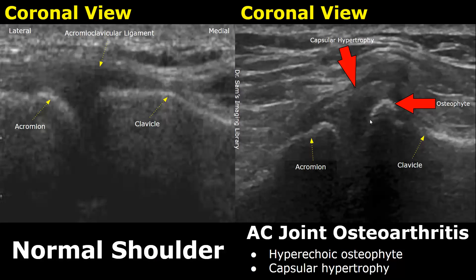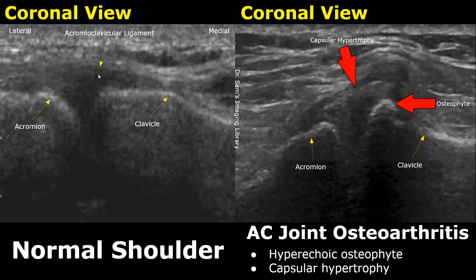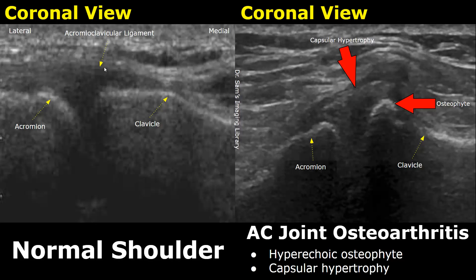Now we will examine the acromioclavicular joint. On one side we will see the acromion, and on the other side we will see the clavicle. Between these two bones is the acromioclavicular ligament, which appears hypoechoic or anechoic. This is the appearance of a normal acromioclavicular joint.